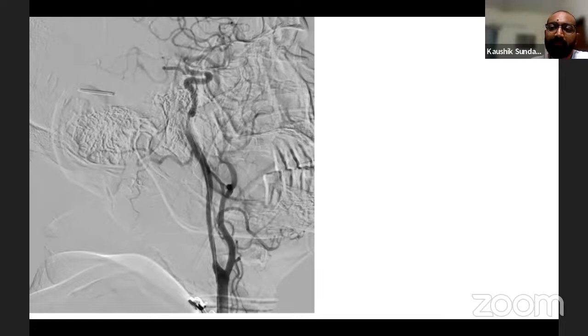So sometimes when you're using coronary, so in these cases, that's what I said, this is a case where I just want to take my Neuron Max up. So I do a balloon plasty. I know my vessel is opening up. I won't even lose a minute. I'll just keep pushing the balloon further up, give a traction, put my Neuron Max up. I'll keep going up, because for me, this carotid, even if it's dissected or it is diseased, it doesn't matter. I just need to go up. After that, I'll come back down and deal with it.